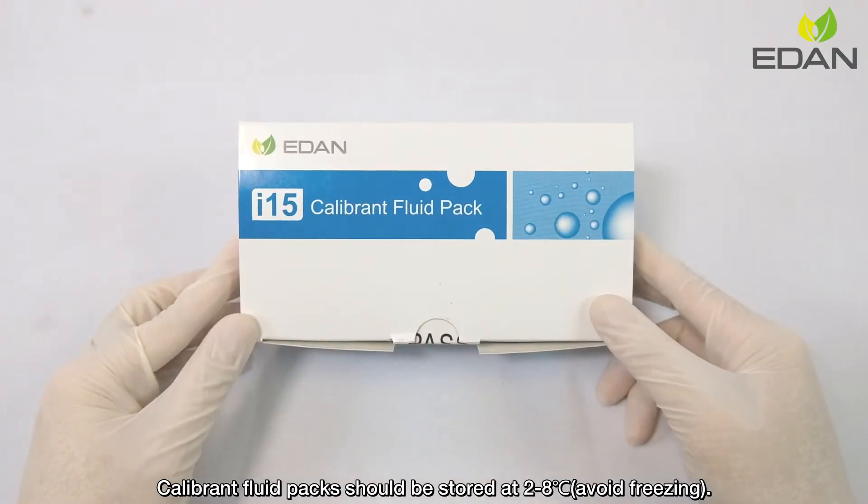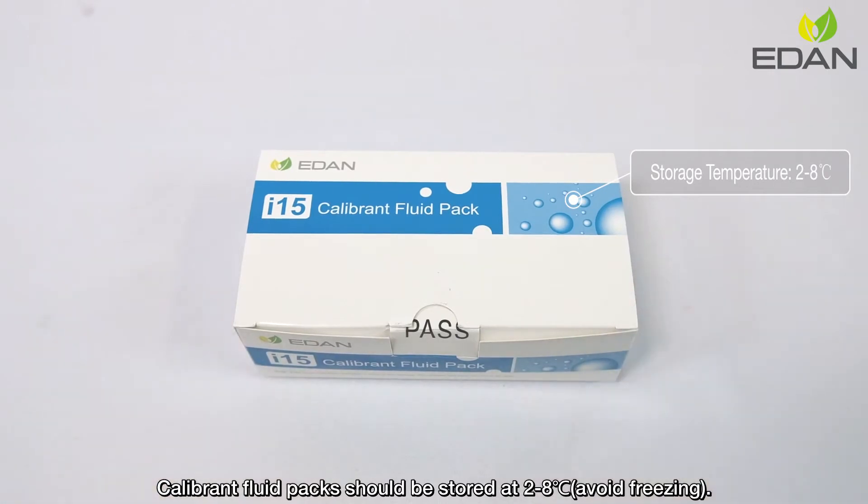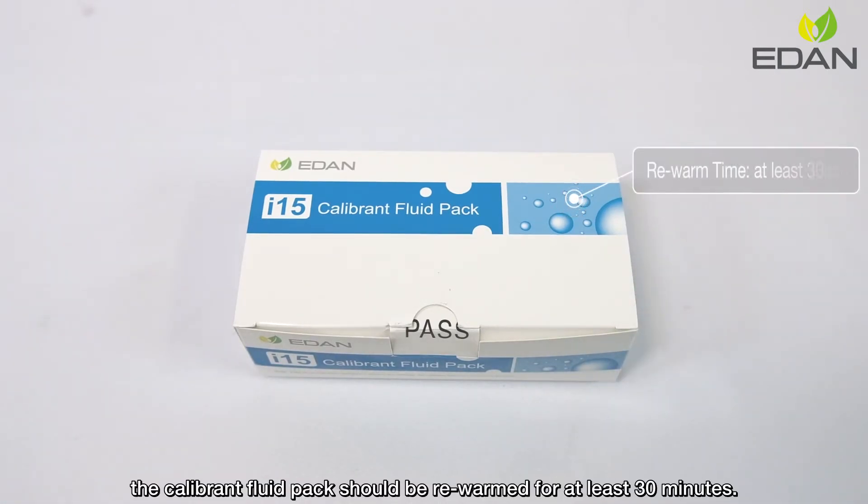Calibron Fluid Packs should be stored at 2 to 8 degrees Celsius. Avoid freezing. Before installation, the Calibron Fluid Pack should be rewarmed for at least 30 minutes.